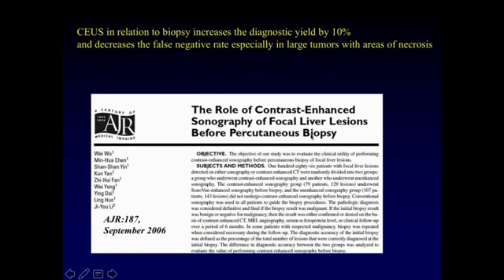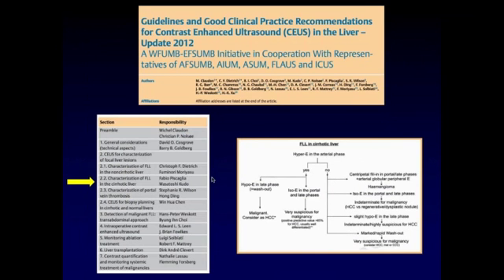This has also been shown in this well-done study from China by Wu. They showed that you can increase the diagnostic yield by 10% if you use CEUS to guide your biopsies. You can also use CEUS in another way.